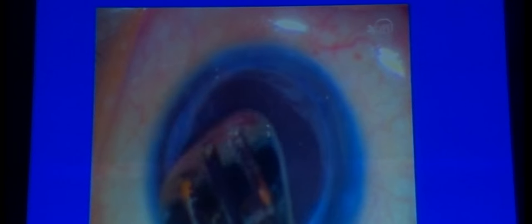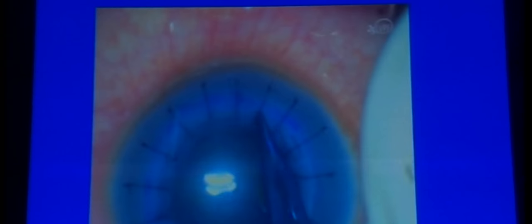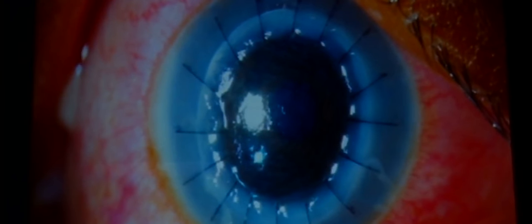In MPS, big bubble DALK is not recommended because glycosaminoglycans deposited within the corneal lamellae prevent air percolation, resulting in a failed big bubble. After many failed bubbles in these cases, manual dissection is preferred. Once 70 to 80% of the stromal bed is achieved in a pristine clear plane, that is the end point for a decent outcome.